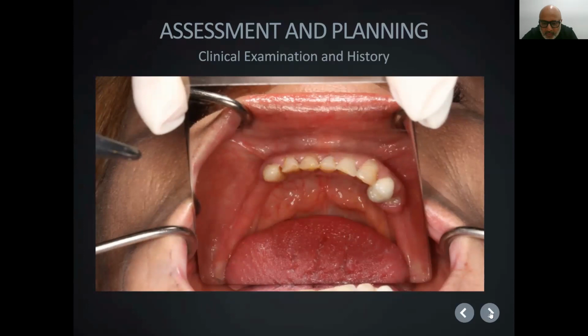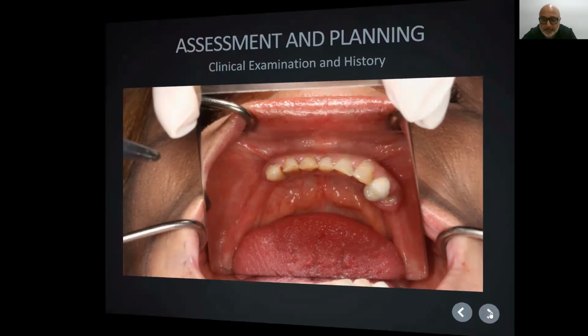The flattened ridges are usually a main cause that patients have problems with the bottom with dentures and then seek implant treatment. You can see the foreshortened teeth. And now you can see comparatively, there is actually a fair bit of bone loss, along with a retained root and heavy restorations in the anterior area.